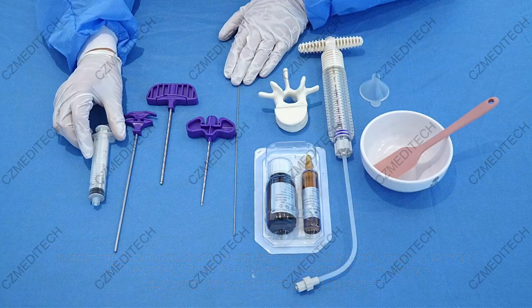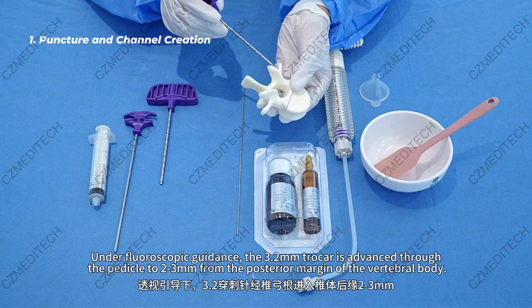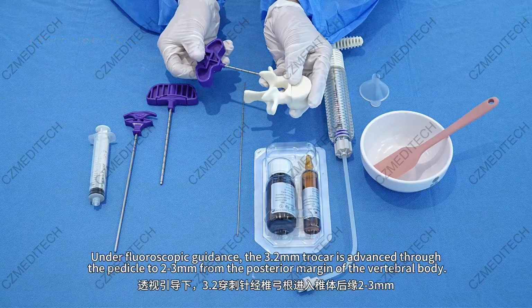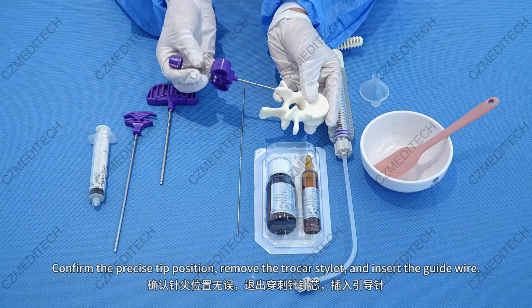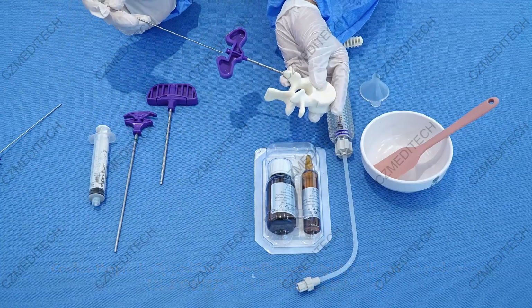Under fluoroscopic guidance, the 3.2 mm trocar is advanced through the pedicle to 2 to 3 mm from the posterior margin of the vertebral body. Confirm the precise tip position, remove the trocar stylet, and insert the guide wire.